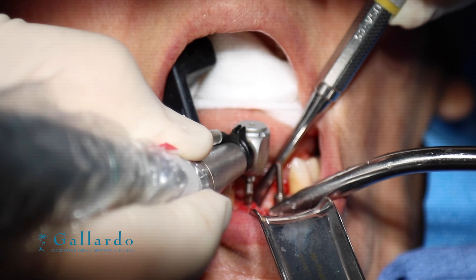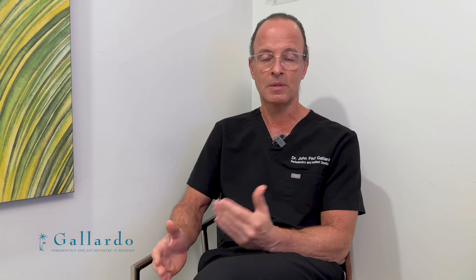This is a nice combination and a common misconception — it's not full mouth extractions every single time. Sometimes we can do one arch all-on-four and then the opposing arch could be basically just traditional implant work, or maybe no implants at all. This was a perfect example of that.